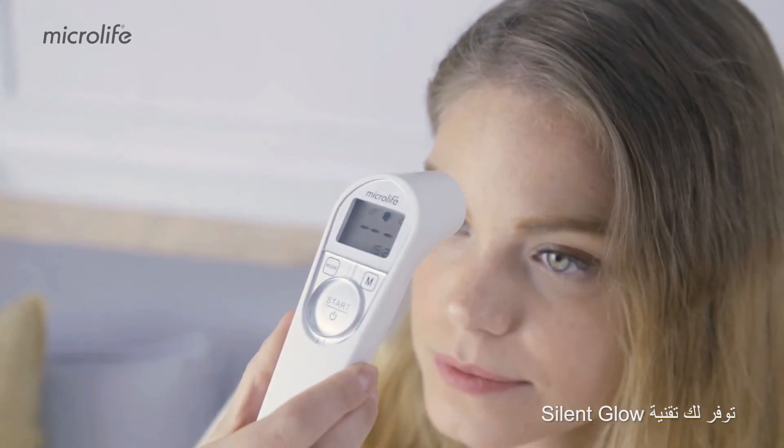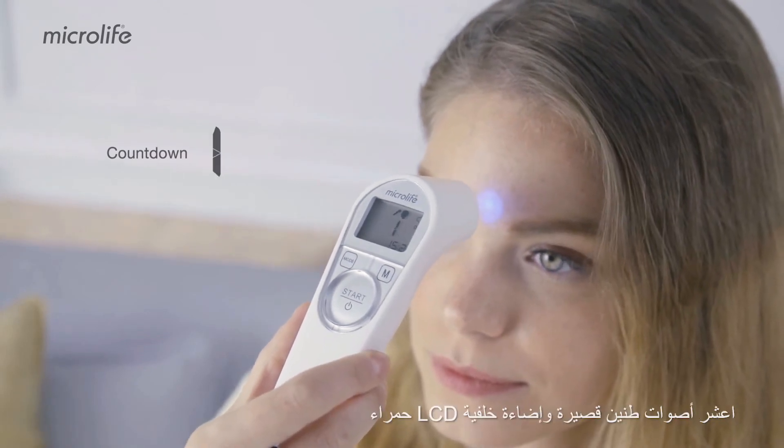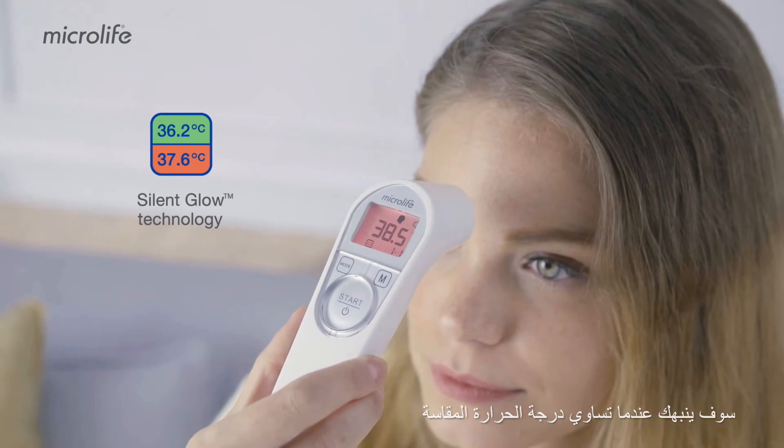The Silent Glow technology provides you with direct information about the measured result. 10 short beeps and a red LCD backlight will alert you when the measured temperature is equal to or higher than 37.5 degrees Celsius.